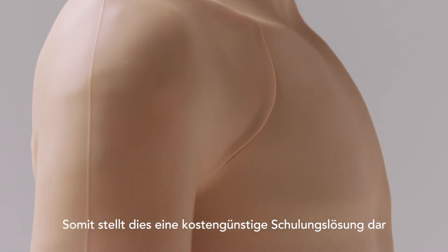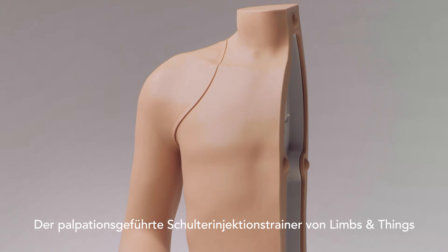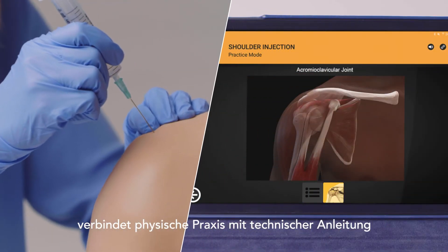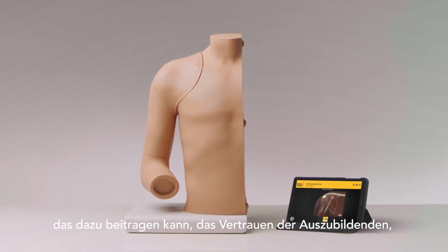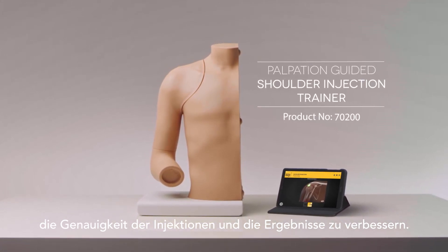Making this a cost-effective training solution, the Limbs and Things Palpation-Guided Shoulder Injection Trainer combines physical practice with the guidance of technology. It provides repeatable training that can help improve trainee confidence, accuracy of injections, and patient outcomes.